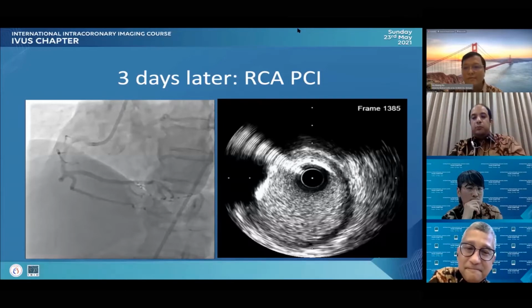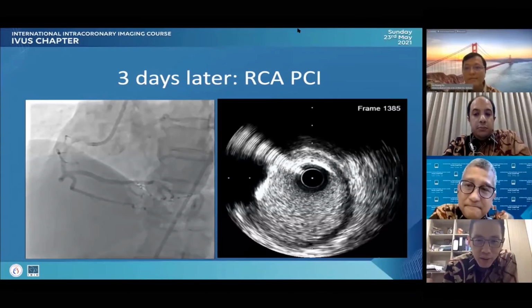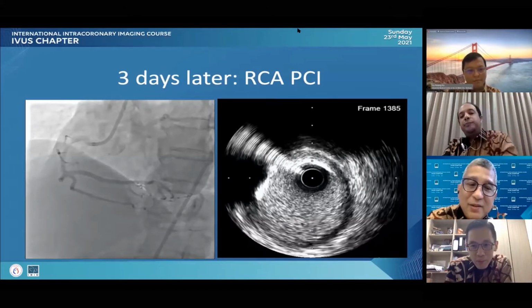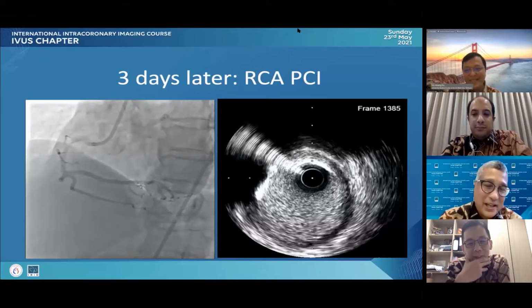In this case, looking at it angiographically, I probably would have gone ahead to treat, but looking at the IVUS it may well be that, because quite often I'm pleasantly surprised by physiology when you do FFR, for the RCA in particular. Tight 80% lesions may give an FFR of 0.85. So yes, I think it's possible, right. But anyway, Dr. Vu has planned to intervene in this kind of situation. So okay, let's proceed, Dr. Vu, please.